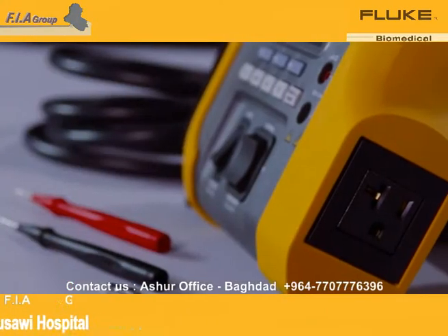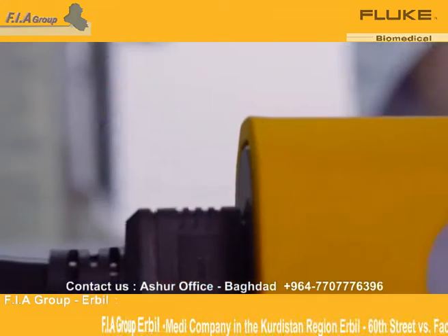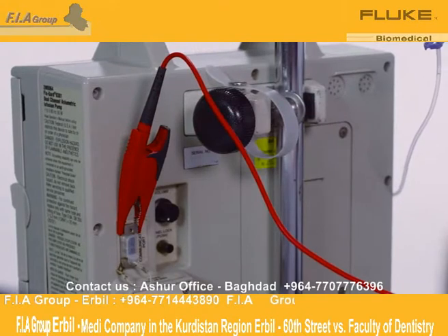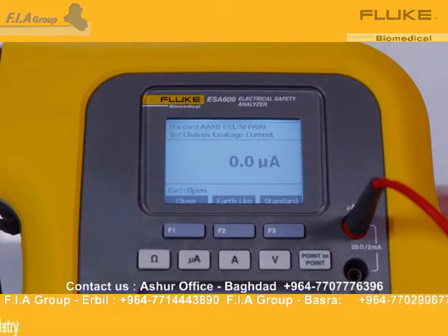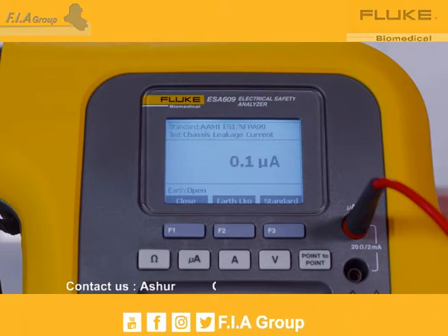Next, plug the device under test into the ESA-609 test receptacle. Connect the lead from the red jack to the device under test chassis test point. Press microamps. The chassis leakage will display. A low leakage current value is required to confirm a safe device.